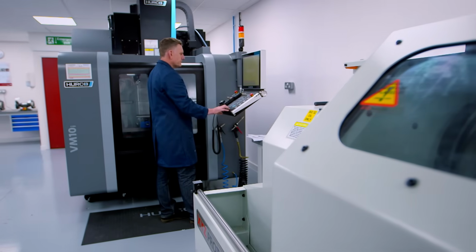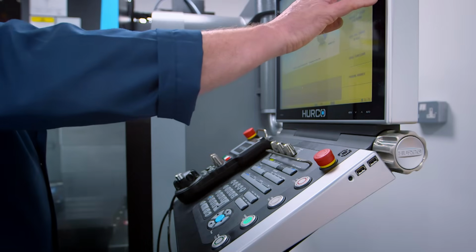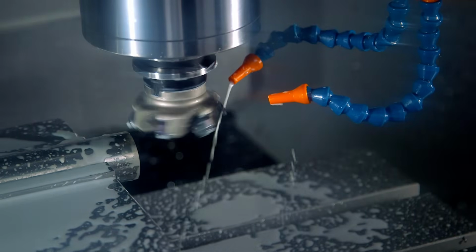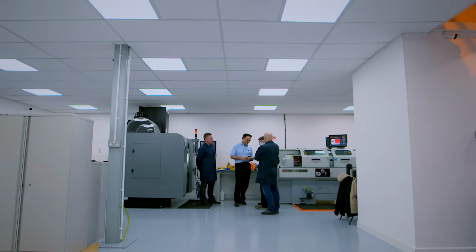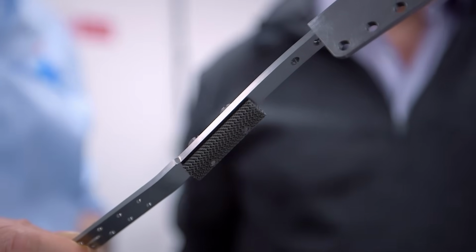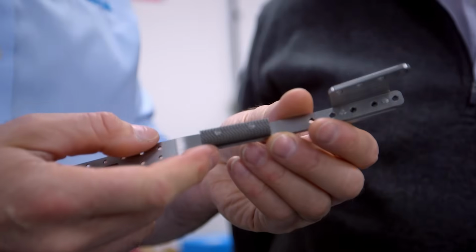At Noel's factory, Fitz Bionics, Izzy's bespoke implant receives the final touches. And biomechanics expert Gordon Blunn is again part of the team. We could do it fairly quickly. Using titanium mesh to bridge such a big gap of missing bone is unprecedented. What I'm hoping to do is take bone marrow, spin out the stem cells, suspend them, put some fibrin glue in with them and spray them in here to stick. Yes. So if we get physical bone to grow down into that, that'll be a world first. Correct.